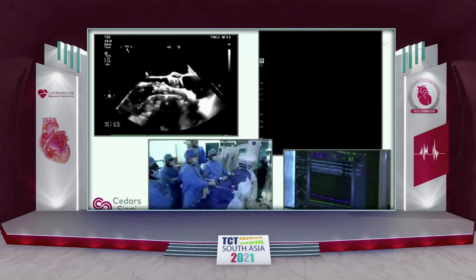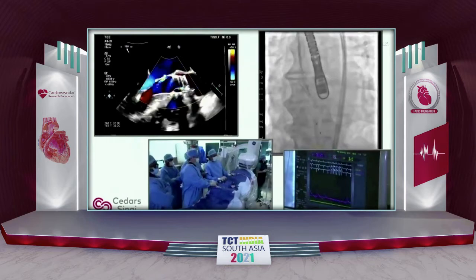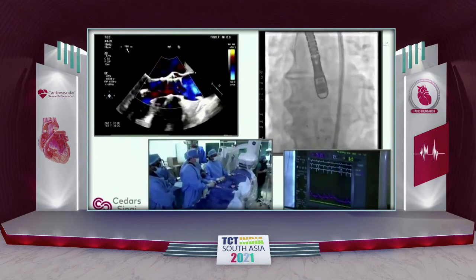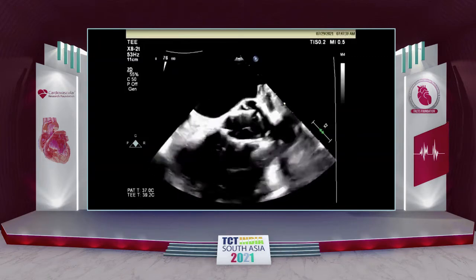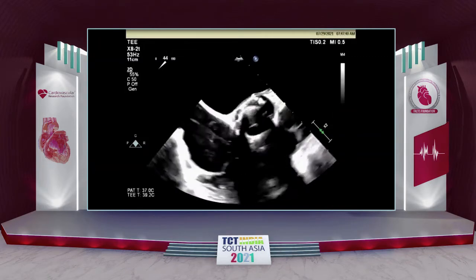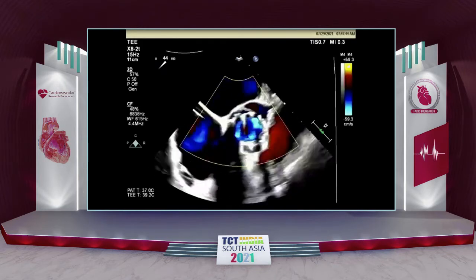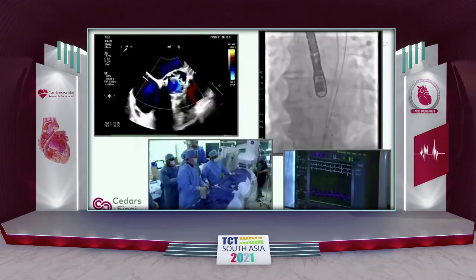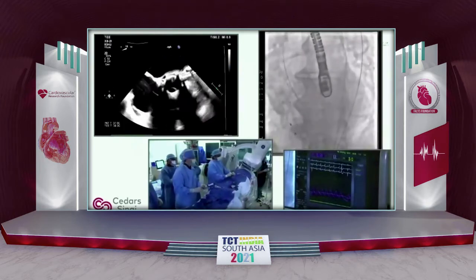So one more CC, and a lot of times you can see that the valve is better expanded. We see this often, even if you keep the volume the same and you go up. In this case, of course, we gave an extra CC. Now, let's show you fluoroscopically, the valve is more stretched. Okay, so let's just take this out.